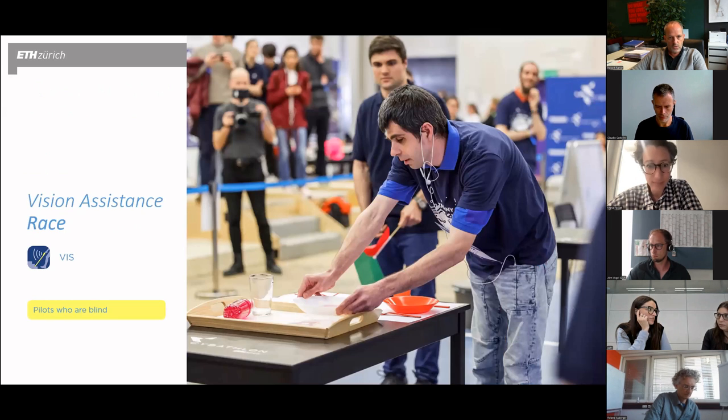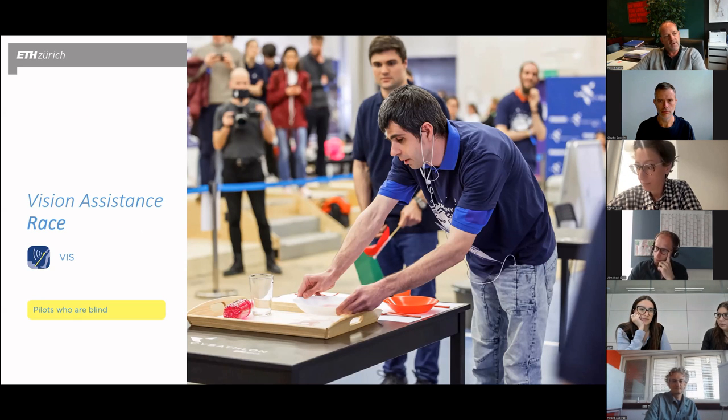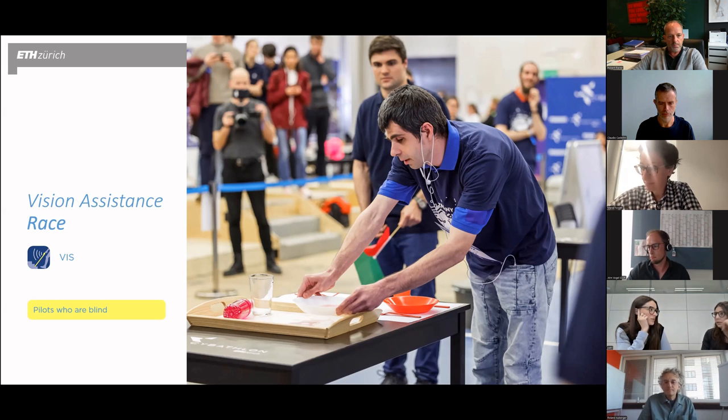In the vision assistance race, people who are completely blind can get supported by any kind of assistive systems, including cameras, for example, and display devices such as speakers and/or tactile devices to get information about the environment, about the surroundings, about the color of objects which they should find and grasp, and so on.